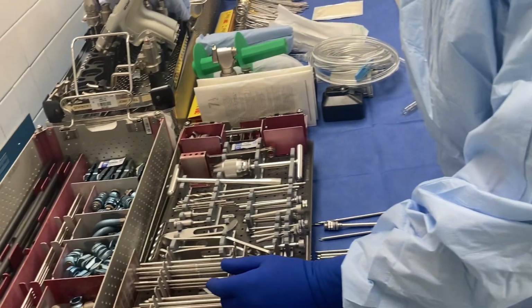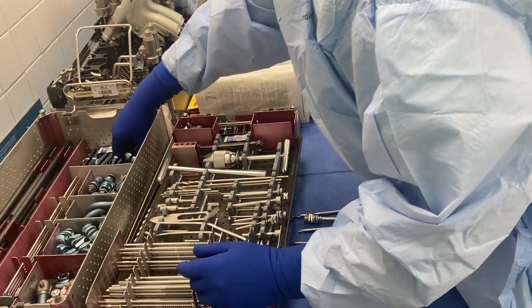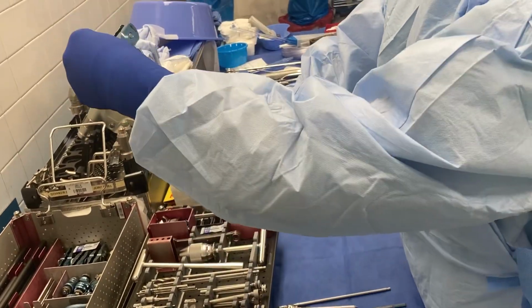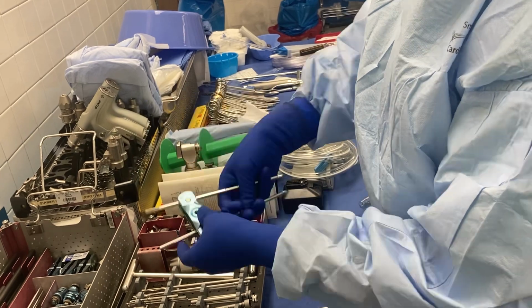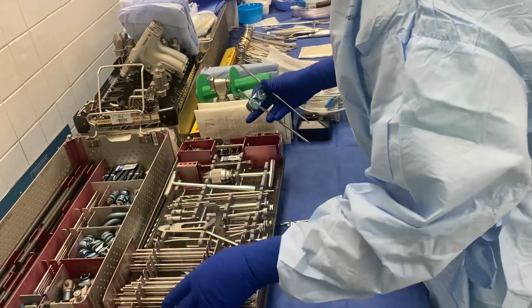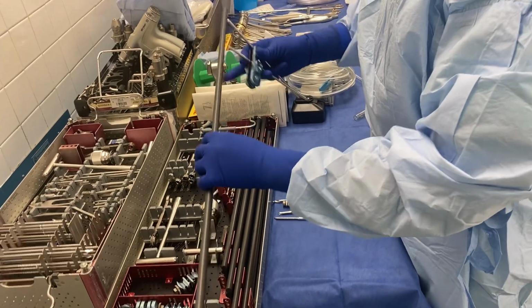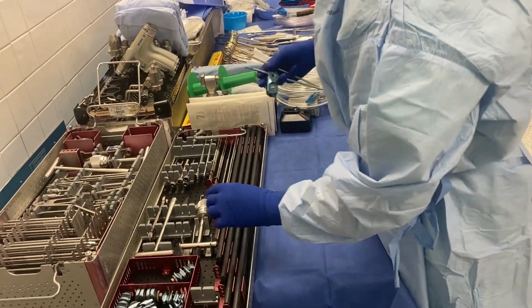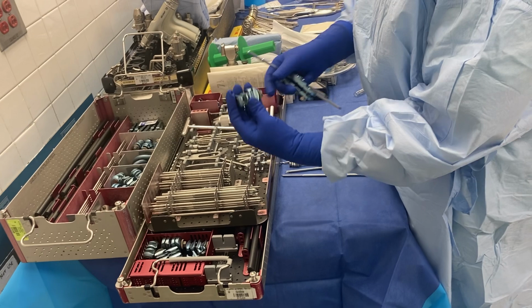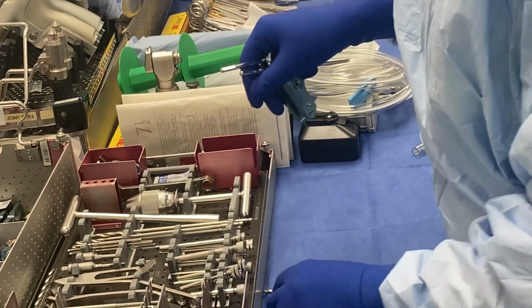So once we get 4 pins in, 2 pins in the femur, 2 pins in the tibia, most of the doctors here like these 6-pin clamps. So a pin will be in here and here. They'll put this down and tighten it with the wrench that we have here. And then we will use a bar, and since it's spanning, we'll use one of these bars. We attach it to the pins using 2 different clamps, depending on the doctor's preference. So we have what we call combis. These are pin to bars and bar to bars. So they will attach to a bar or a pin, or both.